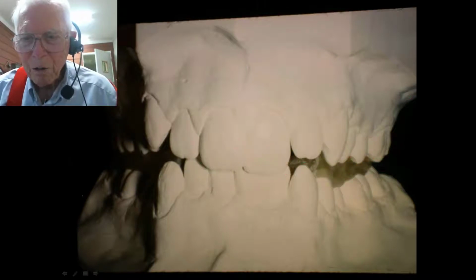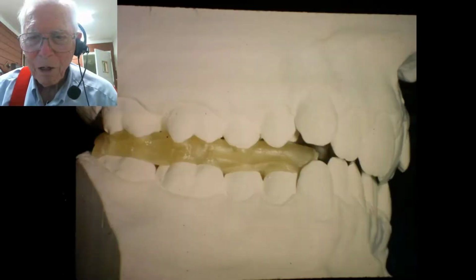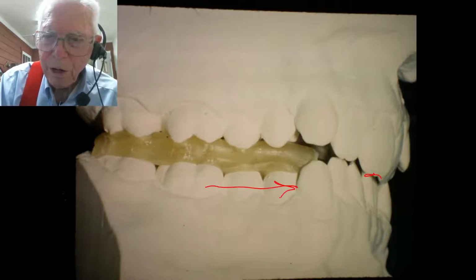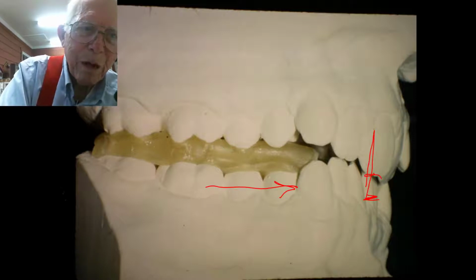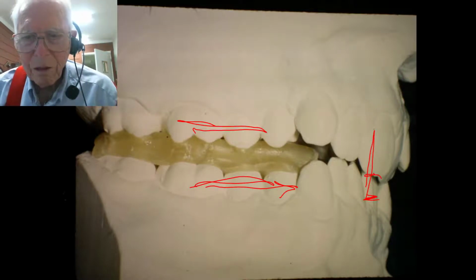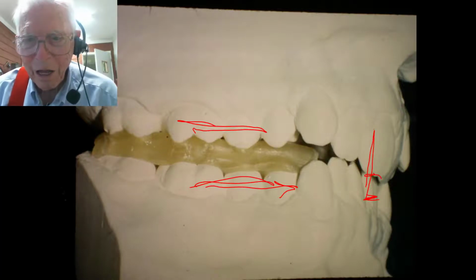But I'm just trying to show you how we made them now, and you might have a better way, I'm not sure. Now we look at the other side, and you see where we have moved the bottom jaw forward here. It would have to go back to fit up underneath there. So by moving it this much distance, the condyle, where the condyle was in the fossa, it would move it up here. And if you were hurting by pressing back here too hard, you get relief from it by just putting this in there. That's a fact. You just reposition the jaw, but then you've got to do something with it, so you can't just go off and leave it like that.